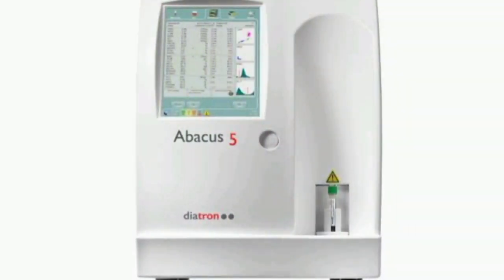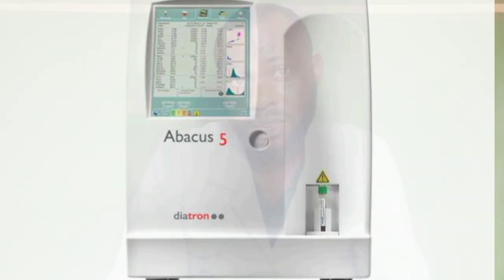So for the fully automated, all you have to do is program the analyzer and place your sample on the rotor or sample carrier. The analyzer takes the sample inside of the machine to where the probe is and aspirates the quantity that it needs for analysis, and of course it brings out the sample when it's done.